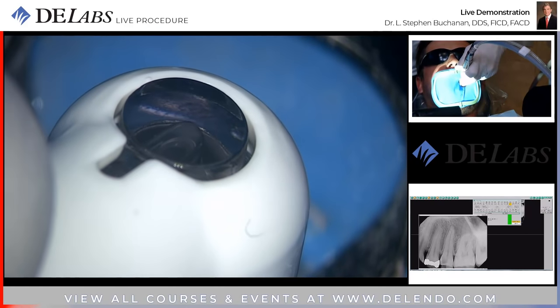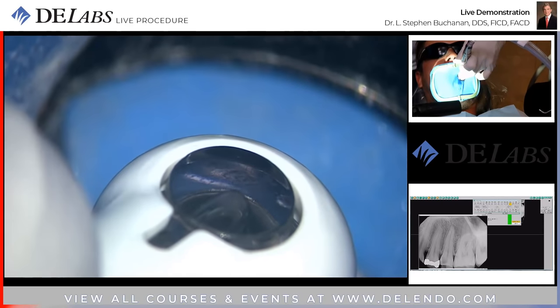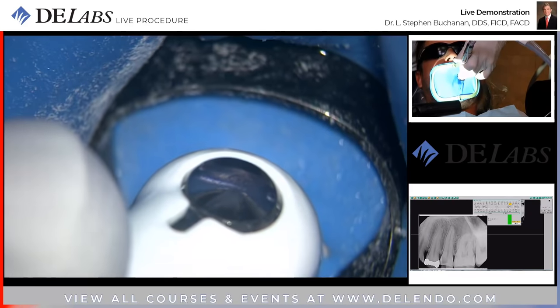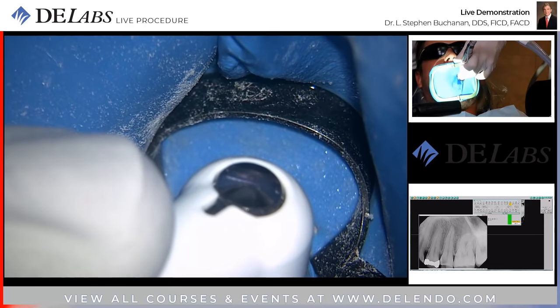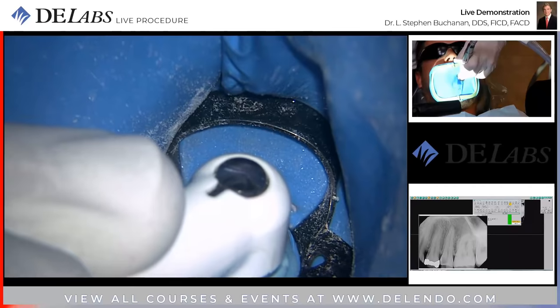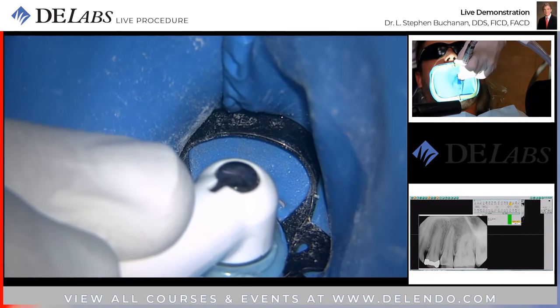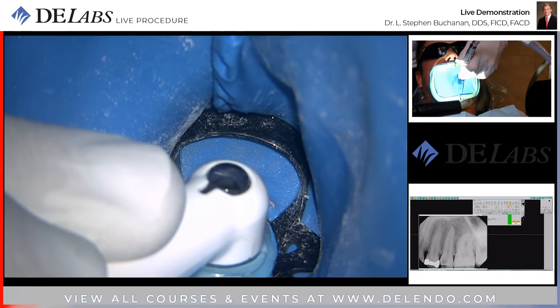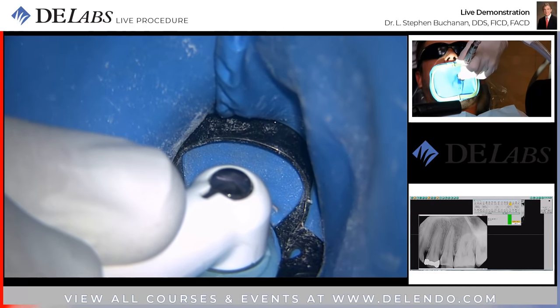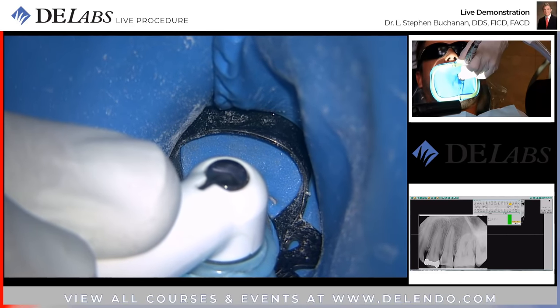You okay there? Doing okay? All right. We're about two-thirds of the way through the root canal. The anterior premolar procedure instrument is a little bit easier to hold a seal on at the top surface of the platform because it's got a spongier little gasket around it.